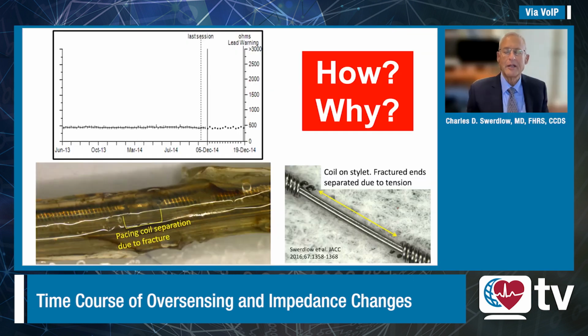Well, Marye and Jeanne, thank you for the very kind words. To provide a little context, historically, the primary diagnostic we've used to identify lead conductor fractures has been an out-of-range impedance for more than 40 years. But more than a decade ago, especially when recalled Fidelis leads began to fracture, the most common clinical presentation was inappropriate shocks caused by rapid oversensing without impedance alerts.